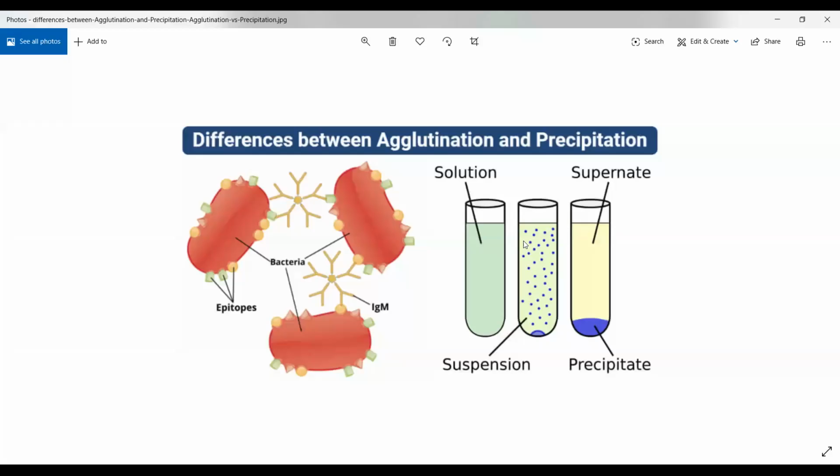अगर आप माइक्रोस्कोपिक लेवल पे देखें, clumps जो फॉर्म होते हैं, they'll be like this. ठीक है? There'll be a direct antigen antibody vertical reaction like this. They will clump together and form small, how should I say, pouches जैसा form कर दे. Okay, there'll literally be small clumps. You'll be able to see once you perform a test, test tube के अंदर. ठीक है? You'll be seeing several clumps like this.